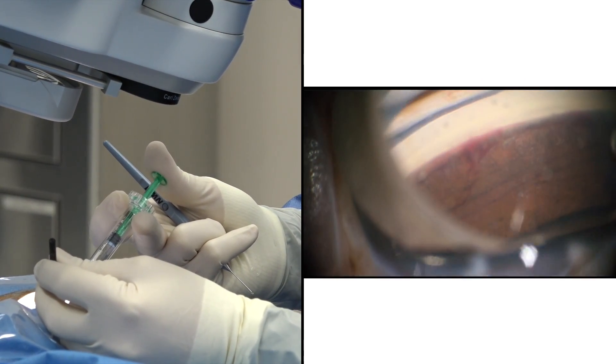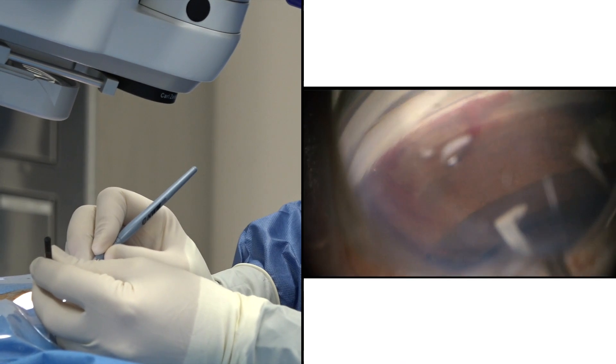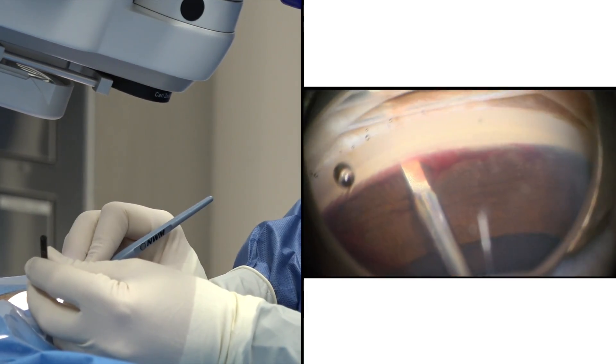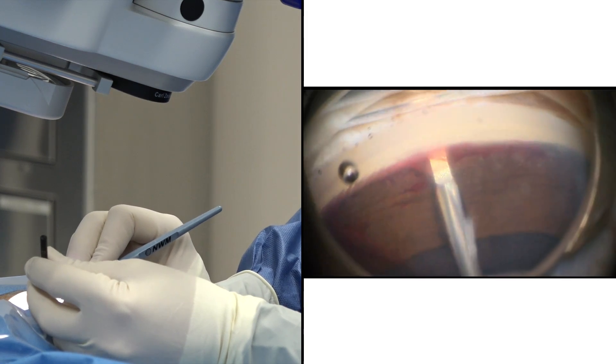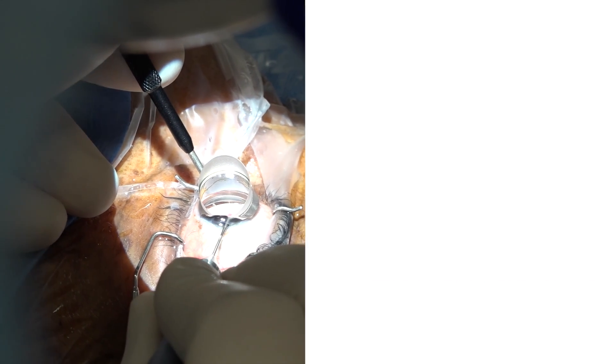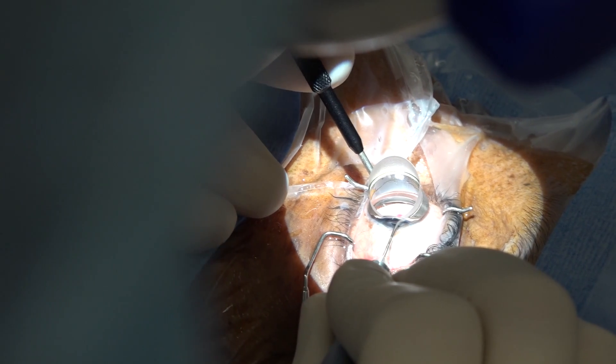Placing more viscoelastic to improve visualization for my second pass, going now in the other direction. So again this is the inside-out technique. You can otherwise start from the ends of the arc and move towards the center, in which case you usually will remove a strip of trabecular meshwork.